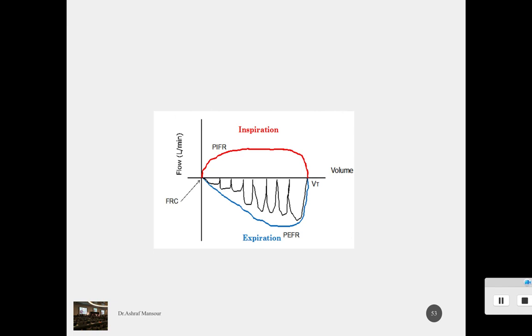The nurse will call you to tell you that the baby is working hard. She will tell you that the blood gas is showing retention. She can tell you that the PO2 becomes less, or the baby becomes agitated, with asynchronization. So just look into this one, you will find the cause. The cause here is secretion, but don't forget that this can occur also from any water inside the circuit of the ventilator.